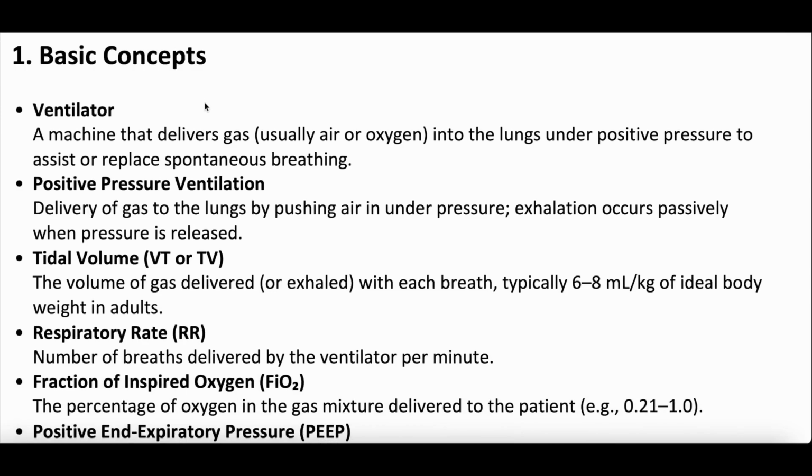So a ventilator, what is a ventilator? I think all of us inherently know what that might mean, but to spell it out, a ventilator is the actual machine that is delivering the gas to the lungs, and it's under positive pressure. And this is a machine that isn't ever intended to fix the lungs. It's intended to give them time to heal from whatever their primary kind of injury mechanism is.